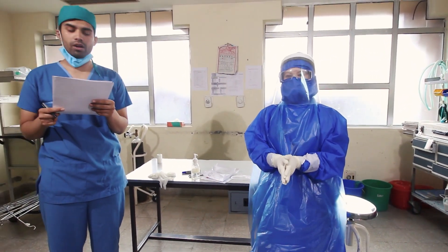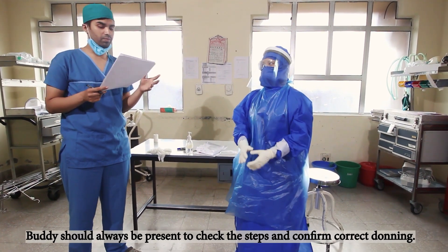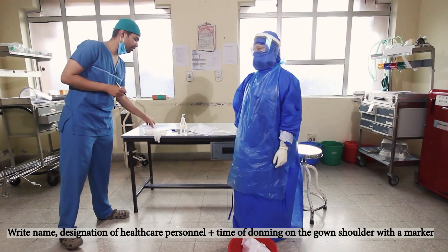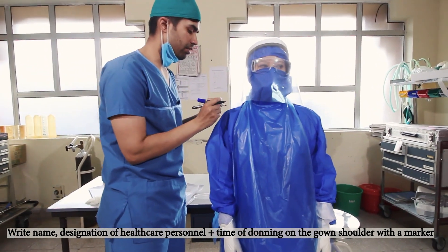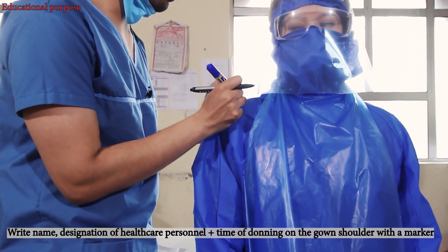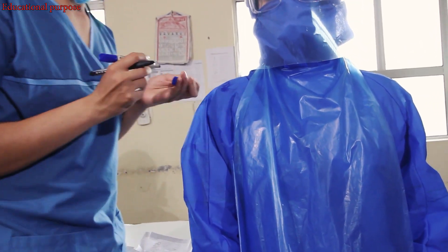This completes our donning process. The buddy should always check and reconfirm each step. At last, we shall mark with a marker at the side — the designated personnel shall be marked. Thank you.